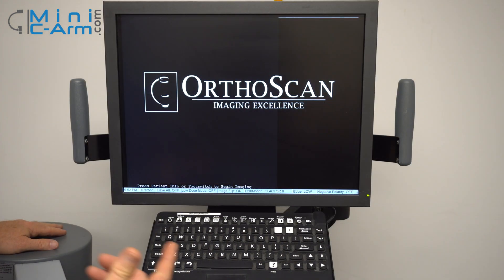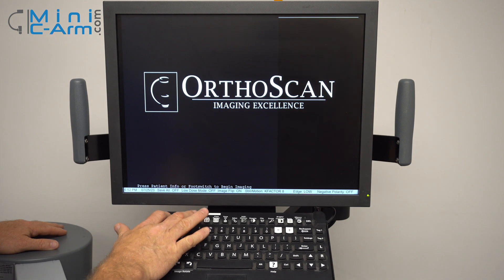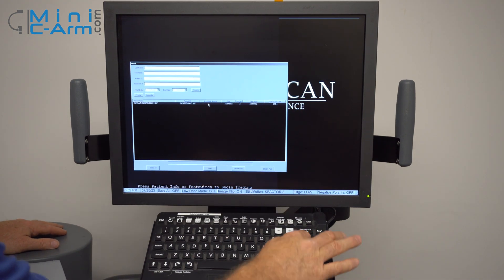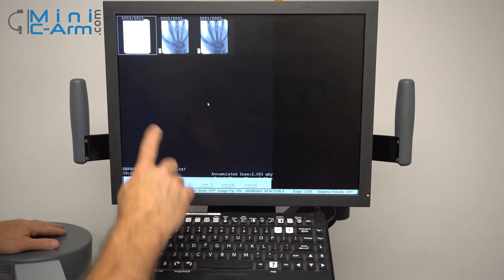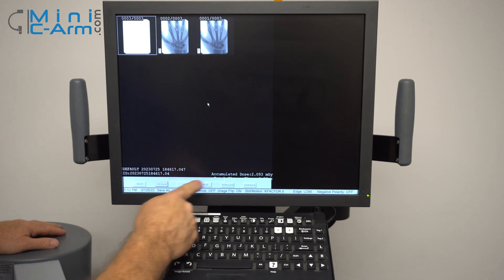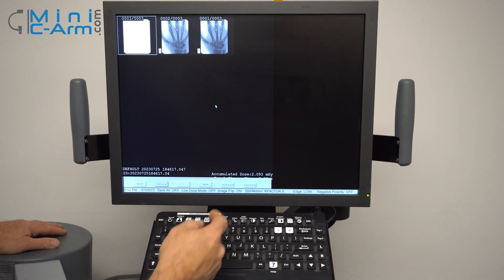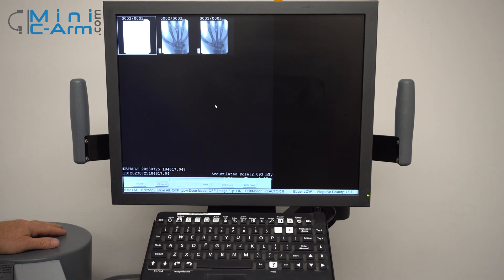When you want to review all the cases that you have on the machine, you can press the recall button. To open it up, press the enter button, and then you can navigate through. You can print from here, send a DICOM, and USB save them.